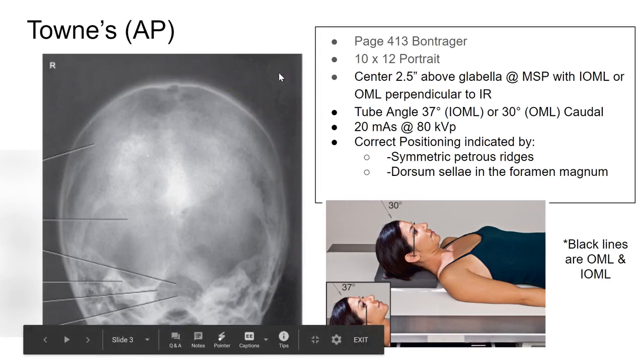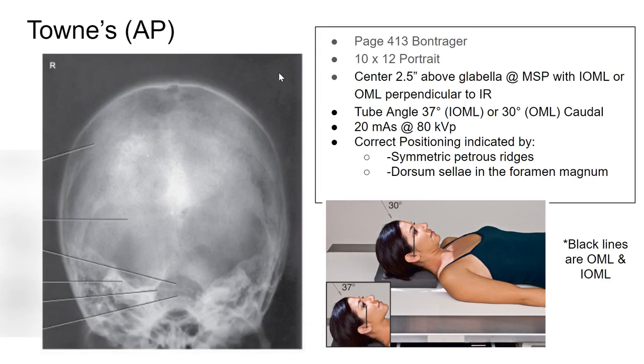Notice we are clipping facial bones. When you are doing a skull projection, you do not need to include facial bones. You just need the actual skull or the actual cranium. So keep that in mind as well.